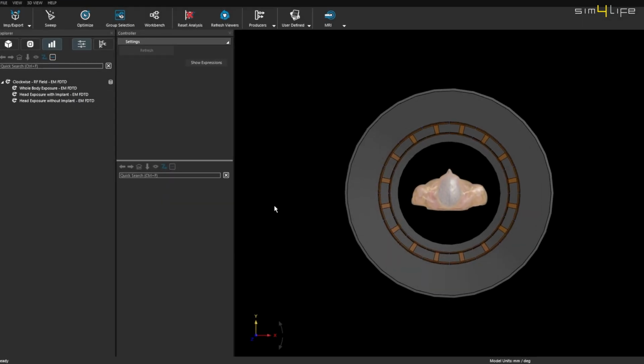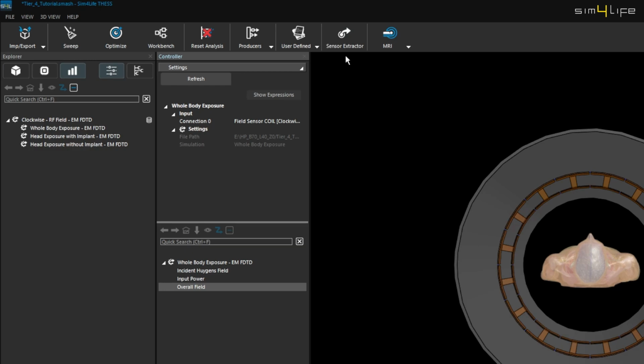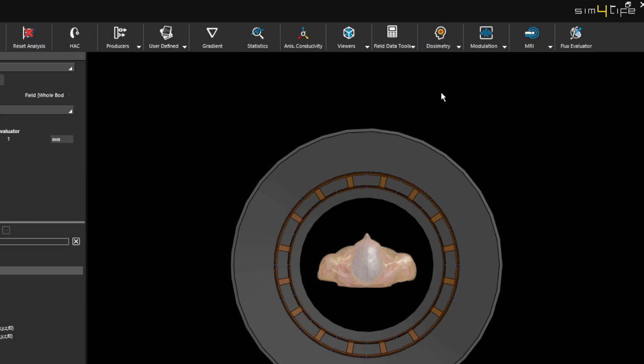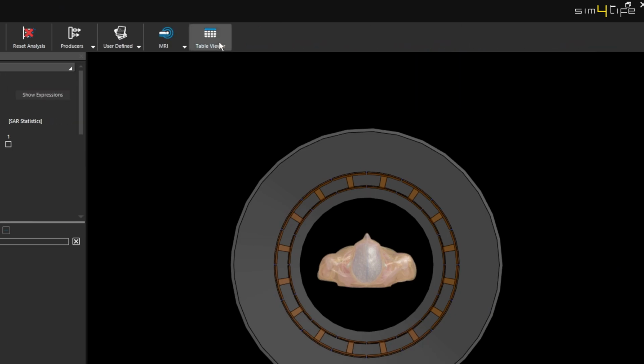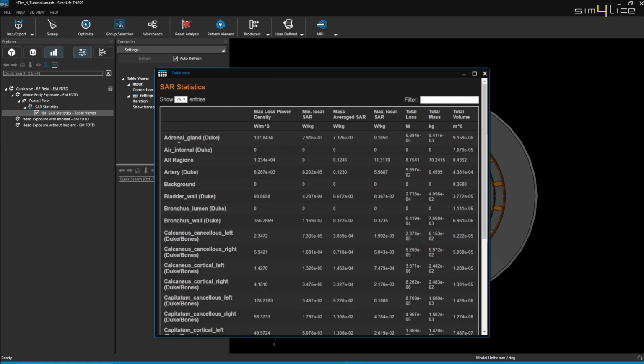To calculate the whole body SAR in the analysis tab, select the whole body exposure simulation. Navigate to overall field, then sensor extractor, and finally, E field. In the ribbon, go to the dosimetry section, select SAR statistics, and open the table viewer.